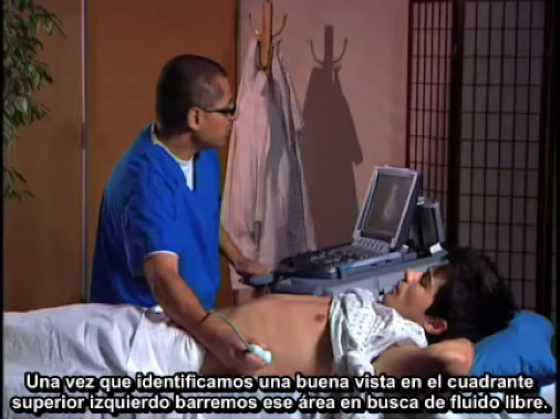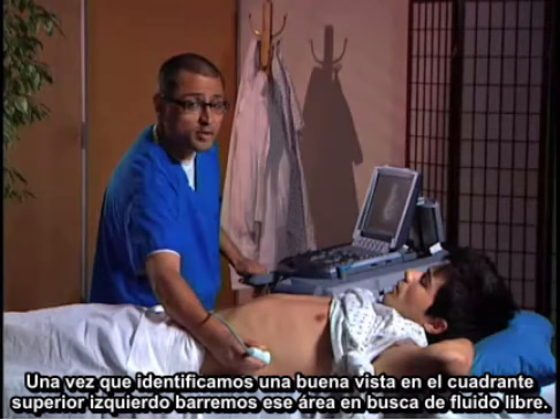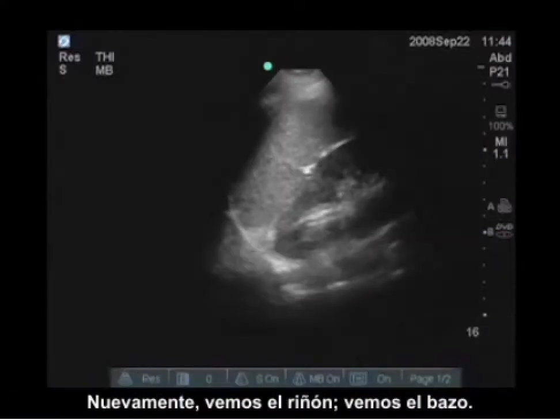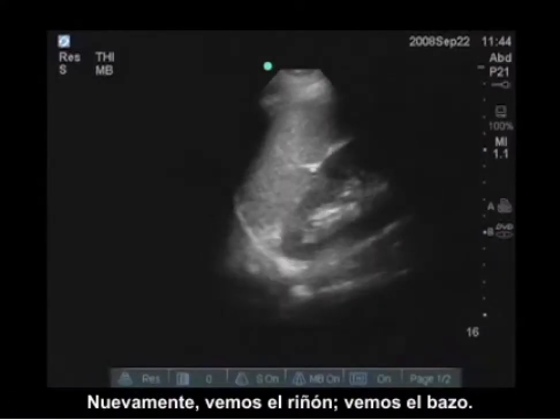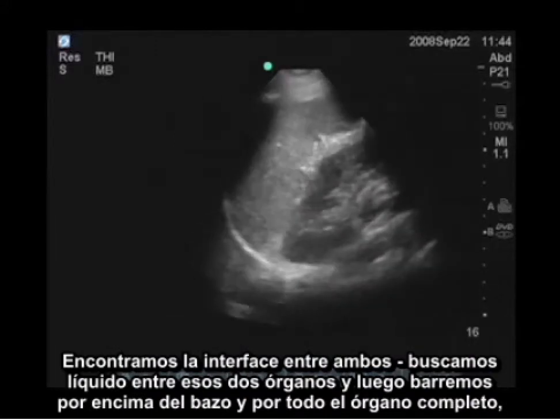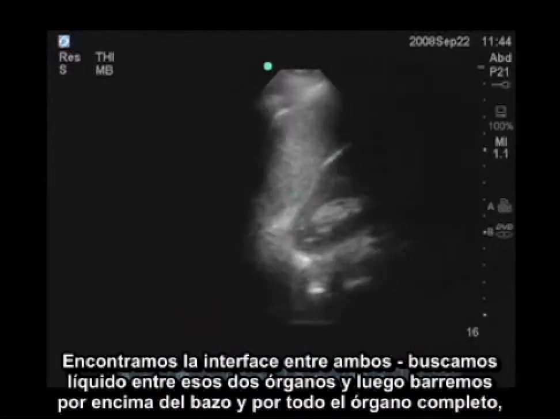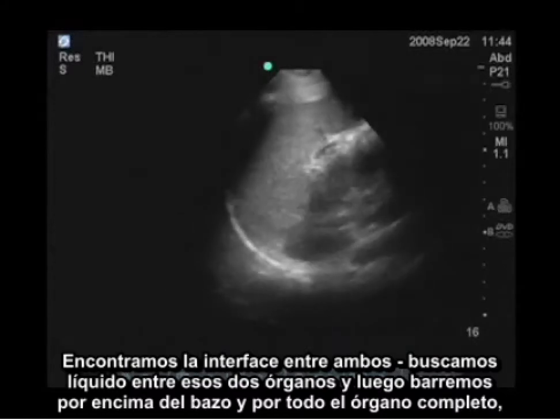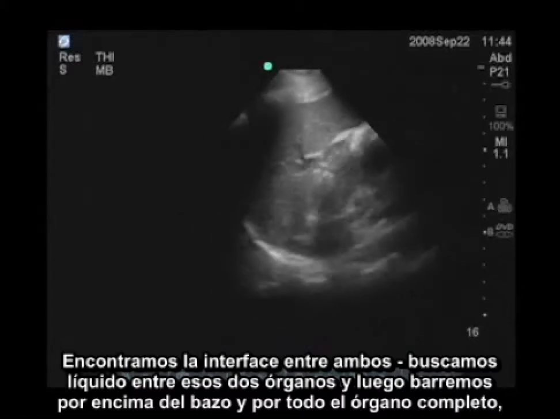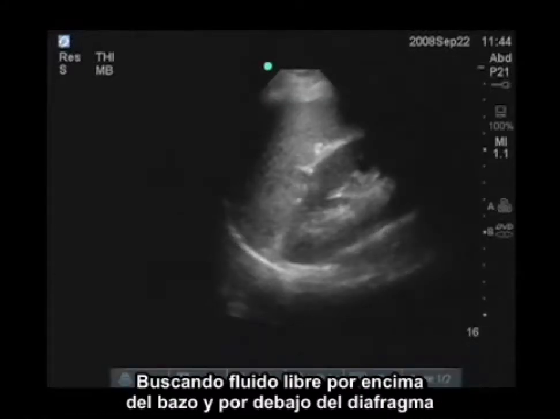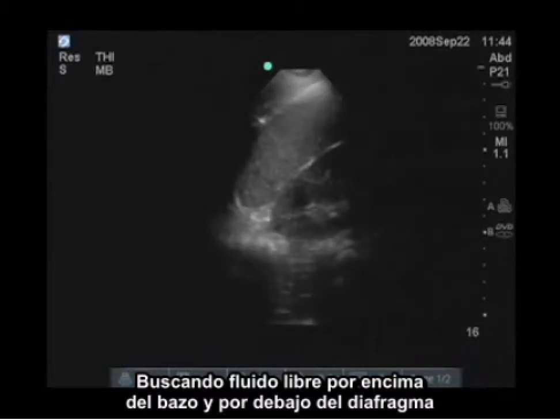Once you identify a good view in the left upper quadrant, you want to do a sweep through that area looking for free fluid. You see the kidney, you see the spleen — find the interface between them, look for fluid between those two organs, and then particularly scan above that spleen, all the way through the organ looking for free fluid above the spleen and below the diaphragm.